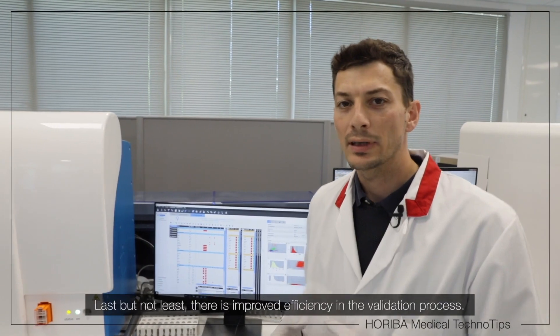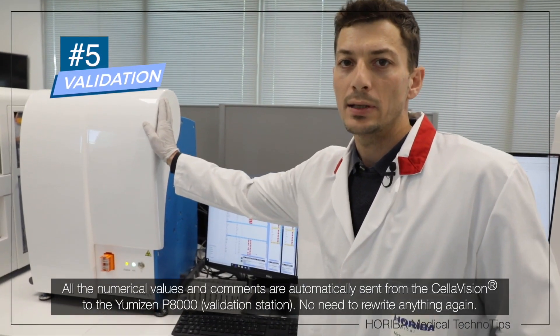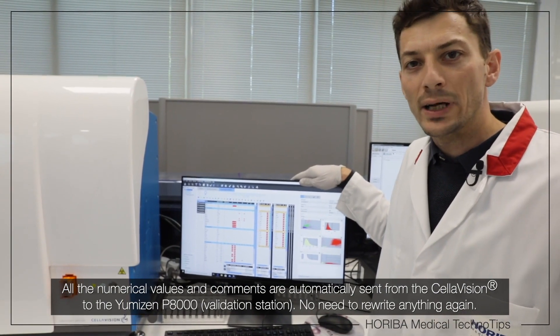Last but not least, there is a speedup in the validation process. All the numerical values and comments are automatically sent from the Cellavision to the Umizen P8000 — no need to rewrite anything again.